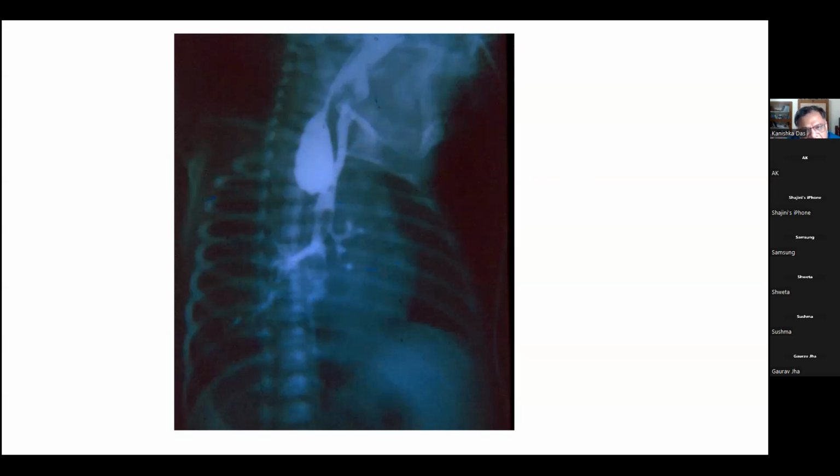Tell me. Because the airway is seen right from the level of the larynx onwards. The airway is seen as dense here and as dense there. So which means it's more likely to be oral aspiration, sir, rather than a fistula. What is the other reason why this is likely to be aspiration rather than an upper pouch fistula? One more reason. Dysmotility, sir. Pharyngeal dysmotility, because of some neurological cause.